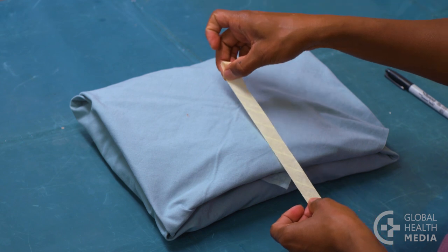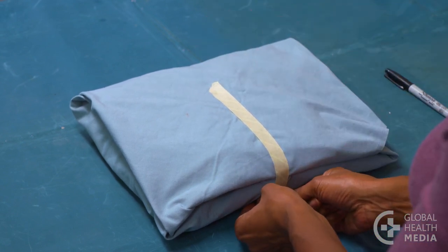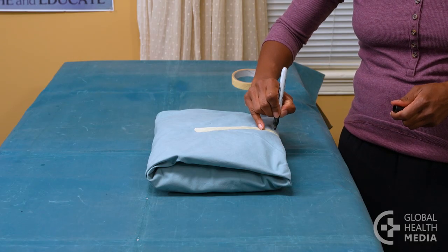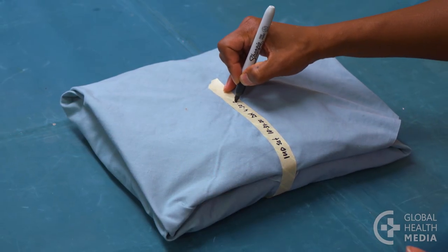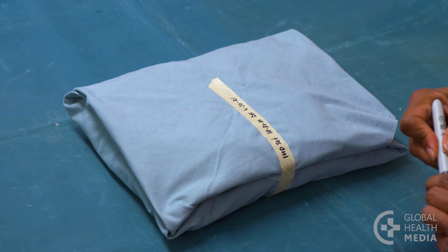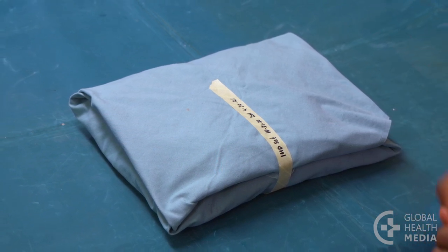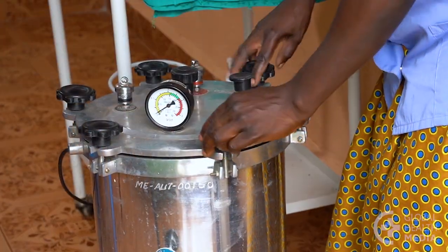Secure the double wrapped package with sterilization indicator tape if you have it. Label the package with the contents, the date, your initials, and the expiration date, which is usually six months from today's date. The pack is now ready to be placed in the autoclave for sterilization.